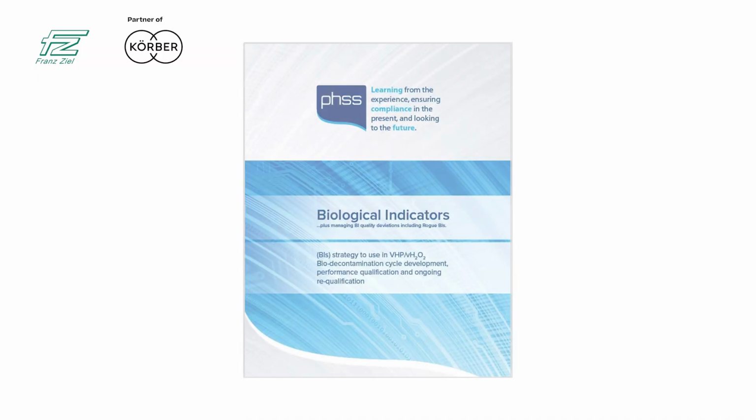And they have now been developed and published through the PHSS as guidance on how to manage these quality variances, in particular rogue BIs, and the impact on cycle development and qualification. Statistical analysis has also been applied to understand the significant impact on PQ qualification studies if rogue BI incident rates are very high. So as a quality control starting point, a strategy of pre-use qualification studies is required to mitigate impactful use of poor quality BIs, particularly the high BI rogue incident rates.